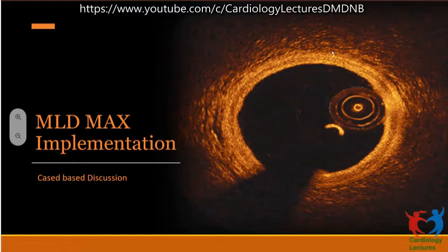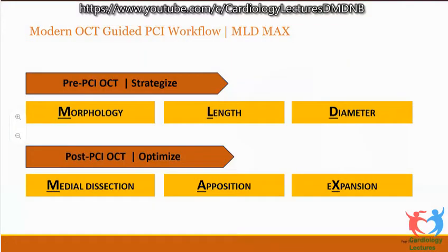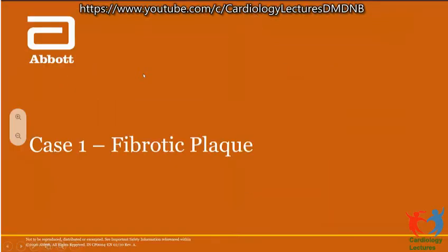So we'll see some cases now. They are essentially going to be based on this algorithm, which is the MLD max. We'll have four cases: one of a fibrotic lesion, a recanalized artery, calcium, and left main bifurcation with provisional stenting. I'm not showing you a calcium case, which I would really have liked to, because I had very little preparation time. So let's go on to the first case, which is a fibrotic lesion.